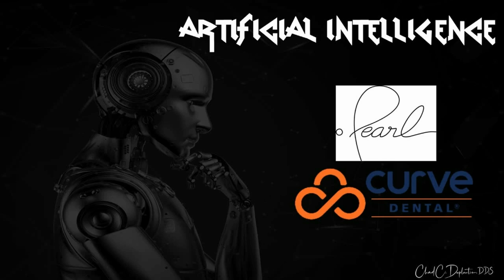Hey, this is Dr. Chad Duplantis, and I'm a restorative dentist here in Fort Worth, Texas. And today I'd like to talk with you a little bit about artificial intelligence and specifically its role in dentistry.